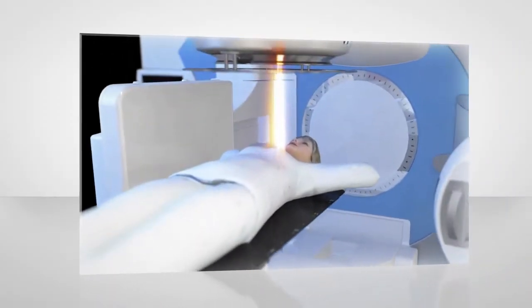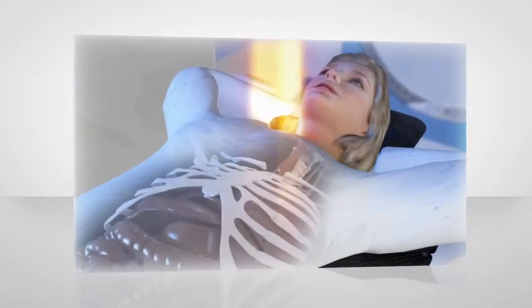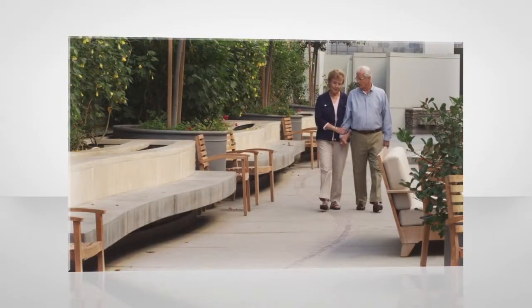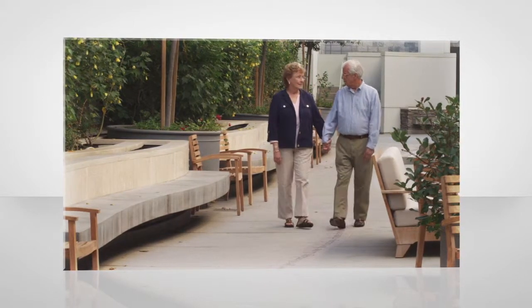VersaHD's extreme precision capabilities support advanced radiation therapy techniques and enable highly accurate cancer treatments. This supports a reduced risk of side effects to help get you back to your busy routine as quickly as possible. Another goal of our therapy is to provide a treatment and side effects that do not interrupt their daily activities, their quality of life.